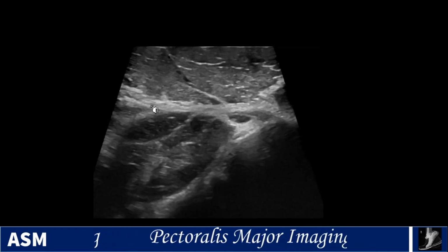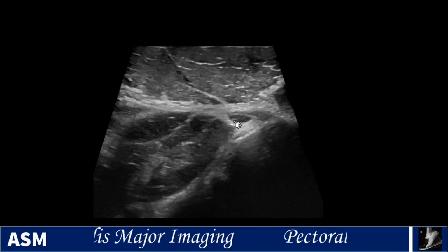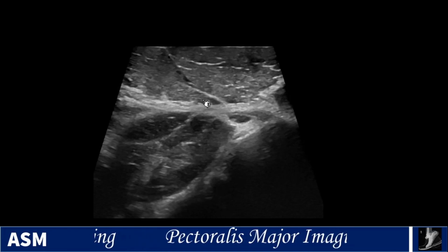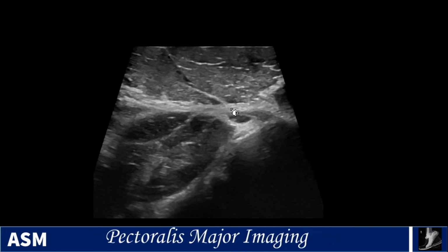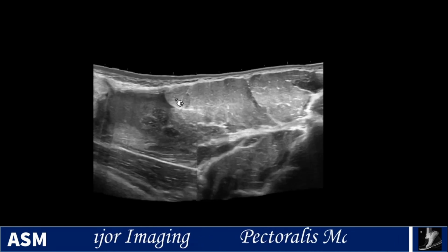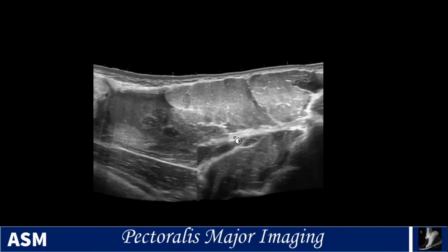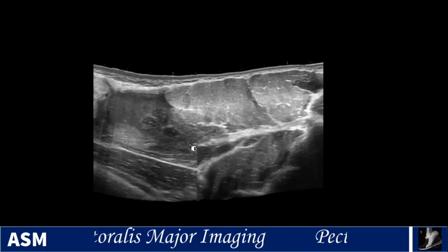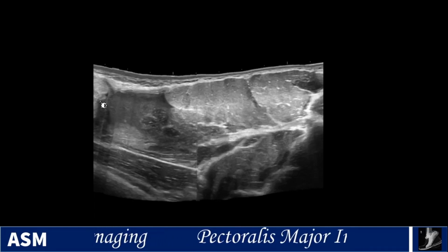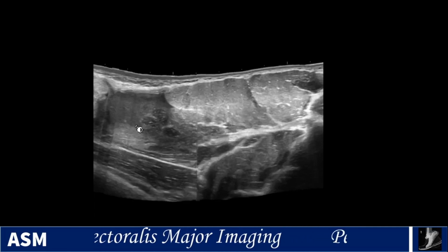And in this case, we have the ultrasound. You can see that tendon coming through here and attaching. We're seeing some anisotropy at the long head of the biceps, the coracobrachialis and short head over here. But we do see the tendon attaching here. And as we start scrolling out medially, we're getting towards that injury. And when you see the panoramic view here, you can see that distal tendon coming in here. But as you get to the myotendinous junction, it becomes a lot more heterogeneous. And then you can see that hematoma and distortion of the normal muscular anatomy where that tear was located.